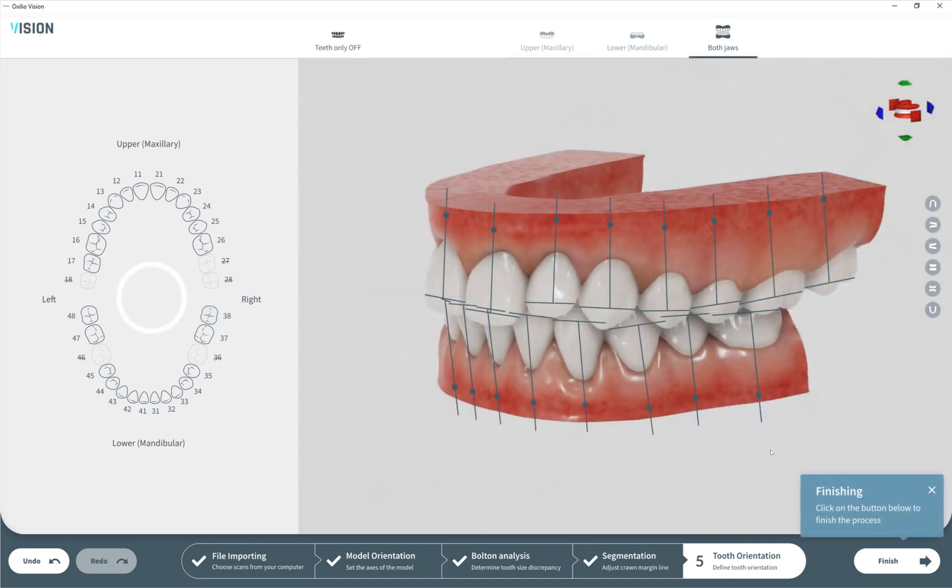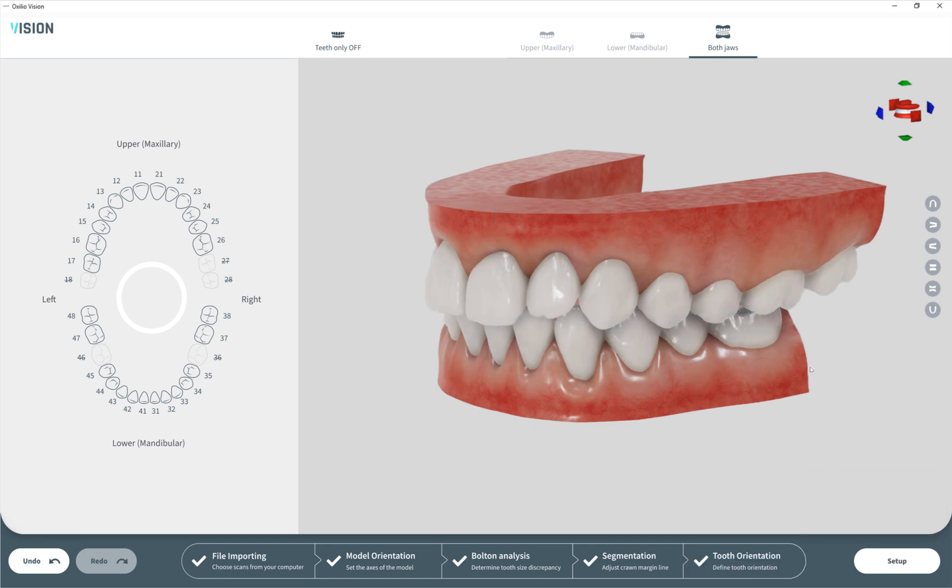By doing this for each tooth, the importing process is complete, so we hit finish. We see a very nice jaw with teeth segmented with correct axes. After that we can go to our setup mode which will have a very different interface. Thank you, have a nice day.